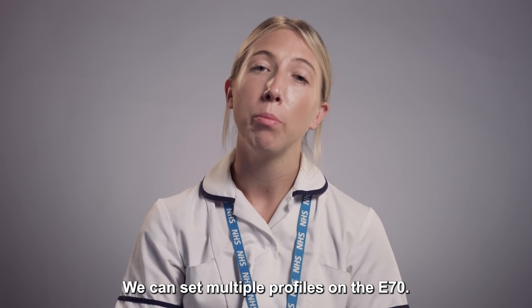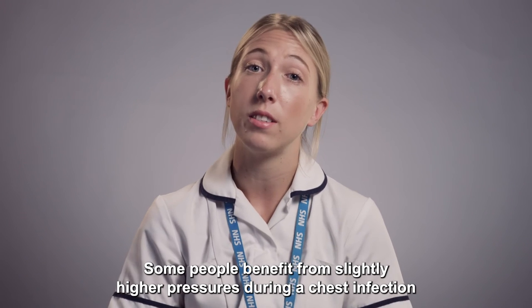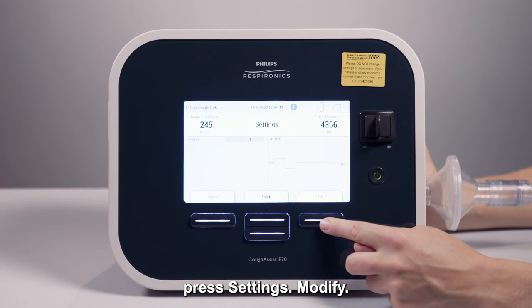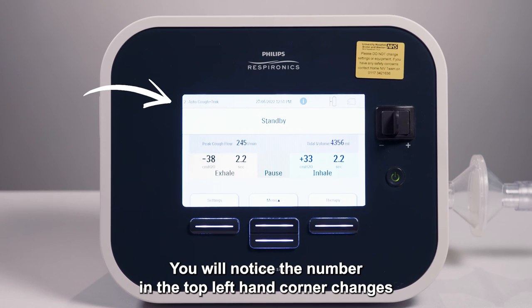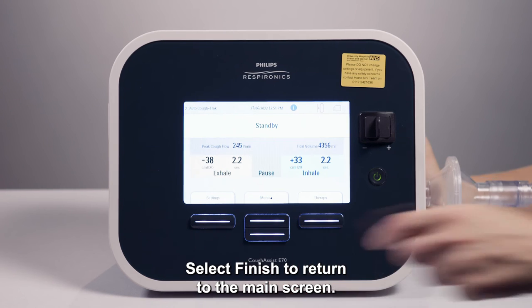We can set multiple profiles on the E70. Some people benefit from slightly higher pressures during a chest infection if they have lots of secretions to clear. To change between presets, press settings, then modify, then use the navigation keys to scroll between the options available. Select OK to confirm. You will notice the number in the top left hand corner changes to match the preset selected. Select finish to return to the main screen.